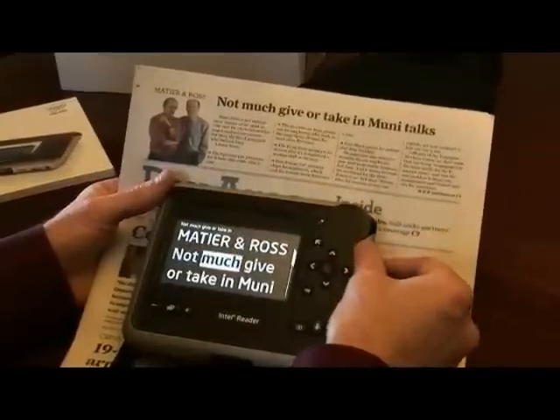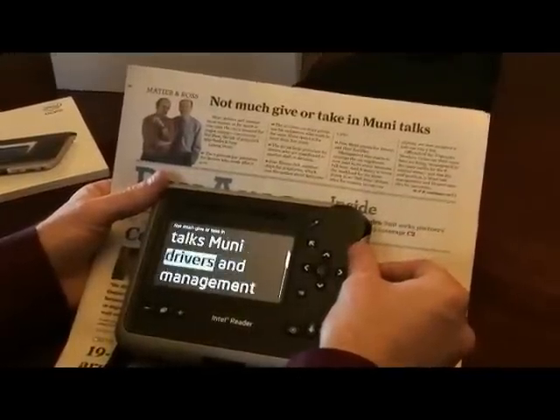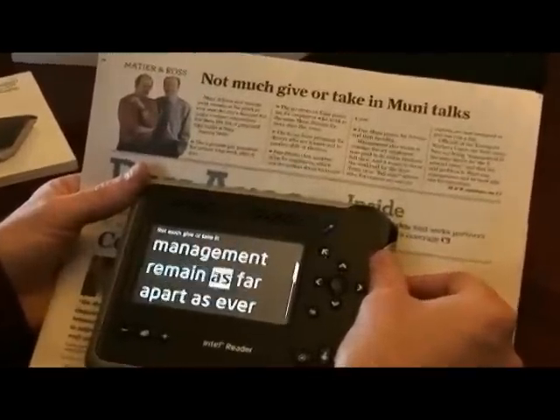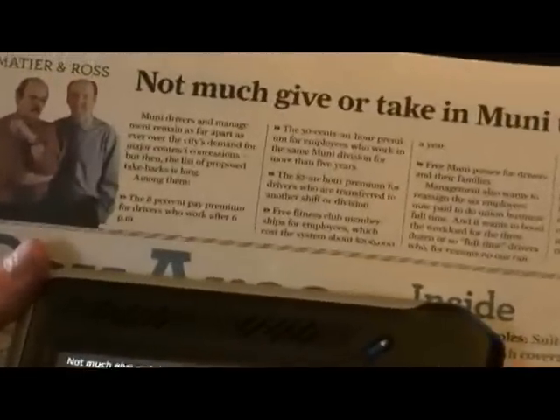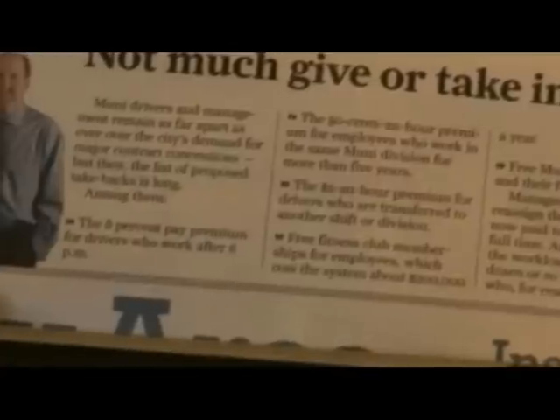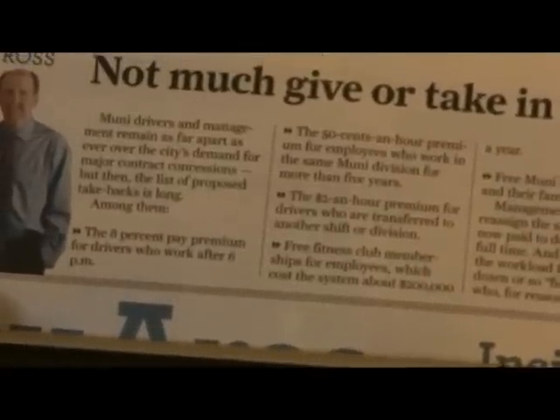The reader begins reading: 'Matier and Ross... Muni drivers and management remain as far apart as ever over the city's demand for major contract concessions... the list of proposed take-backs is long.' So now we're going to do reading one article at a time as opposed to reading the entire fold of the newspaper.